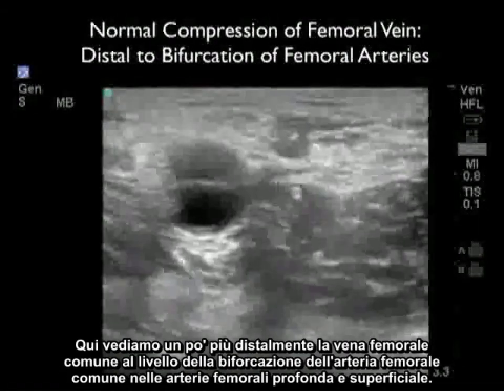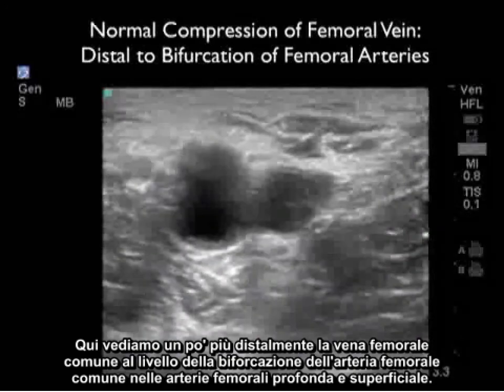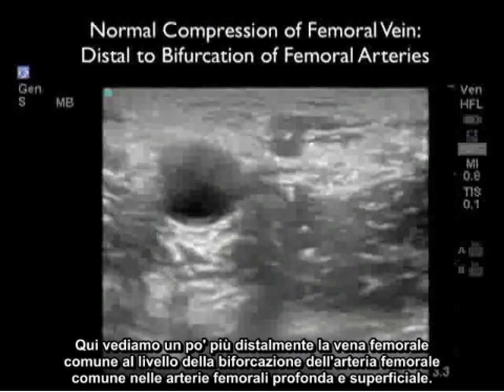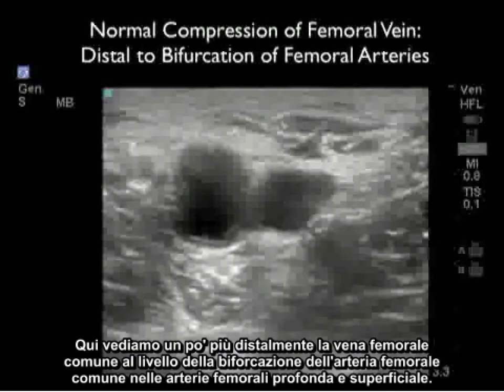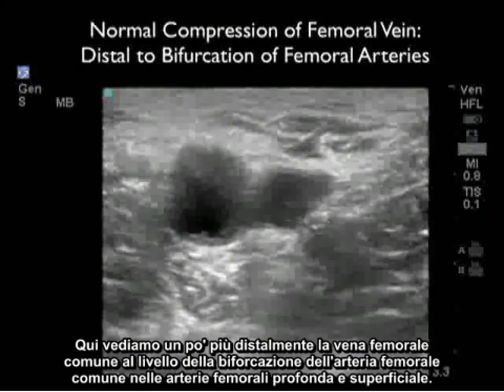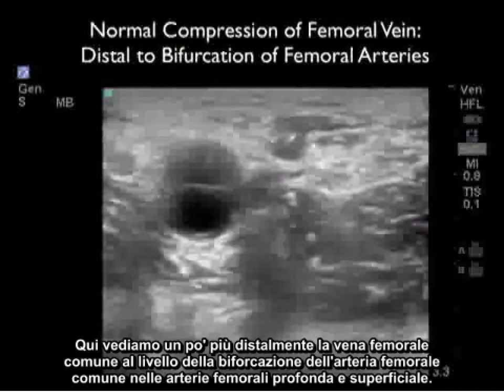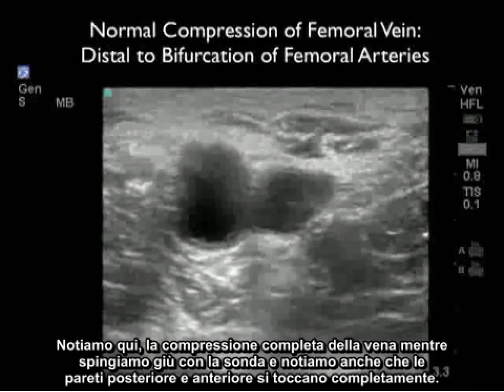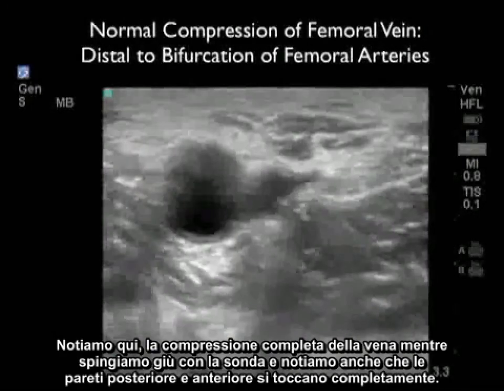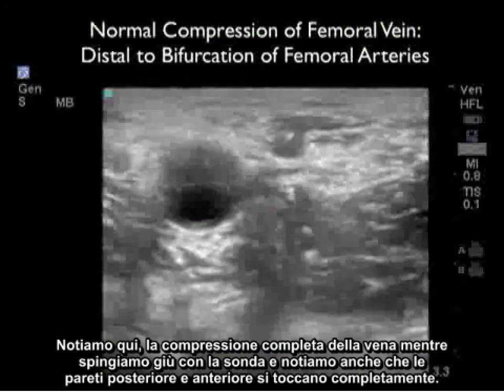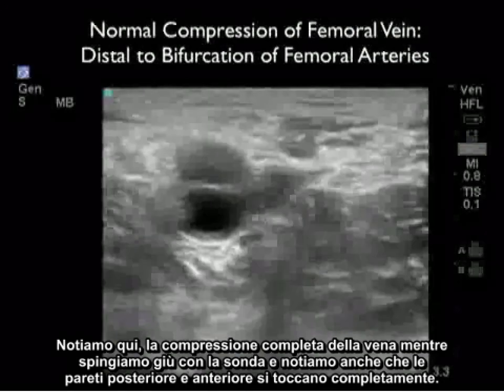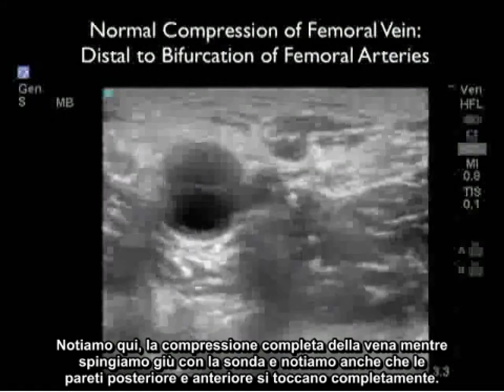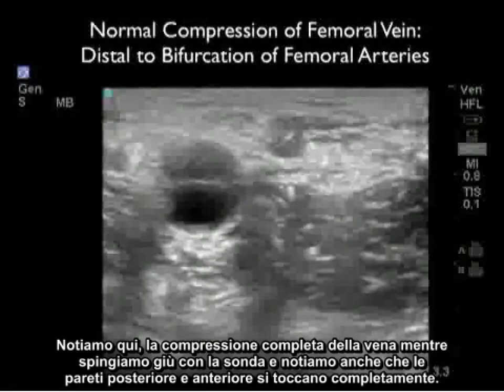Here we're looking a little bit more distally at the common femoral vein at the level of the bifurcation of the common femoral artery into superficial and profundus femoral arteries. We note here complete compression of the vein as we push down with the probe, with the anterior and posterior walls completely meeting together.